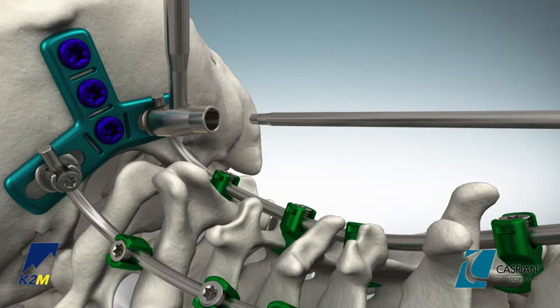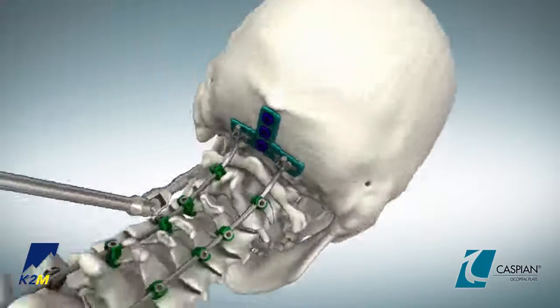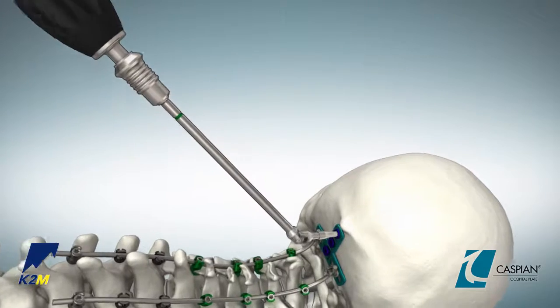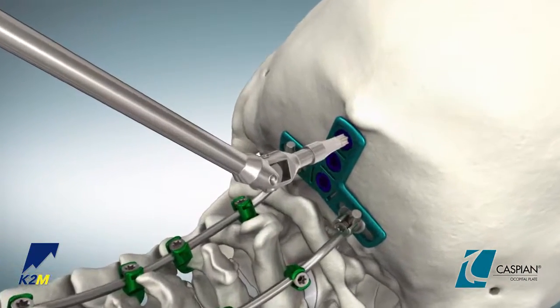Using the size 20 non-tapered screwdriver or universal joint screwdriver attached to the black pear-shaped torque limiting handle, final tighten each of the midline screws in the occipital plate. The black torque limiting handle will emit an audible click when it reaches 30 inch pounds.